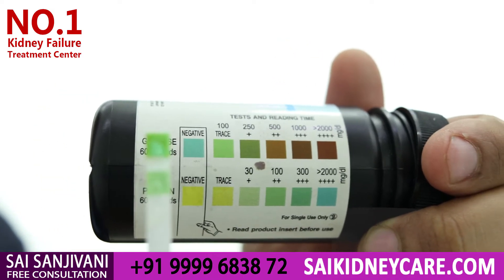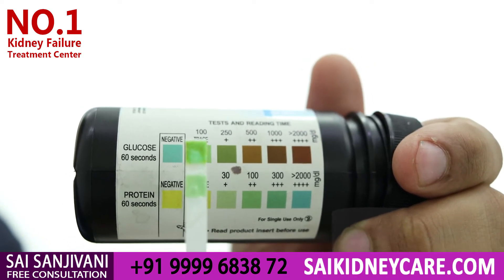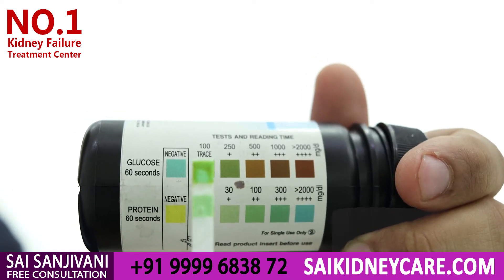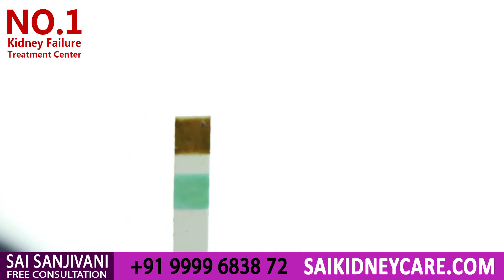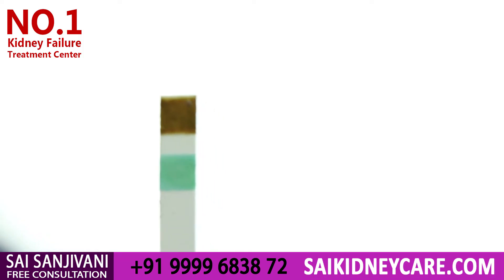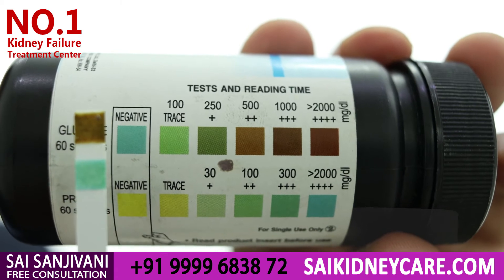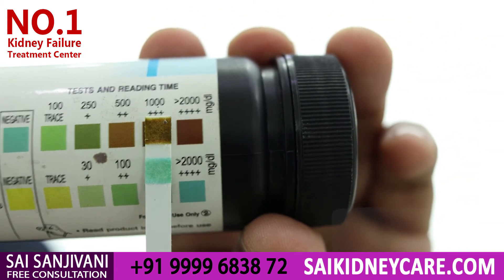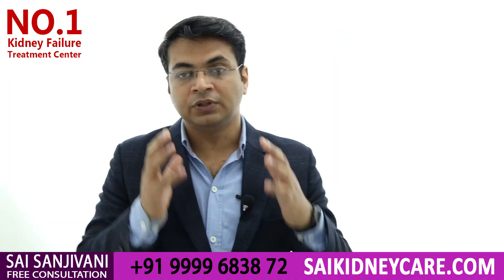The glucose pad has converted from blue to green and is still changing color. Let's wait 60 seconds more so the test can be conclusive. After 60 seconds it is very clear that the glucose level in the urine is also very high — around four plus on the color chart. This is very bad for a diabetic nephropathic patient who is losing both glucose and protein through urine.